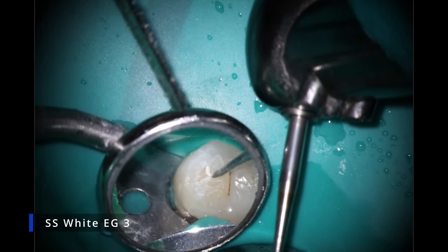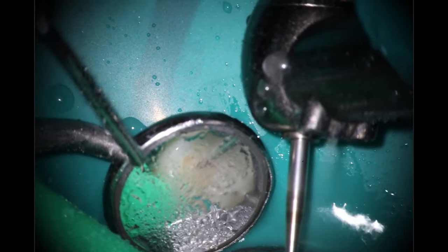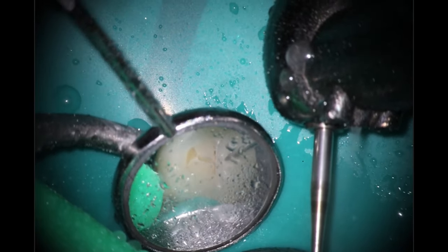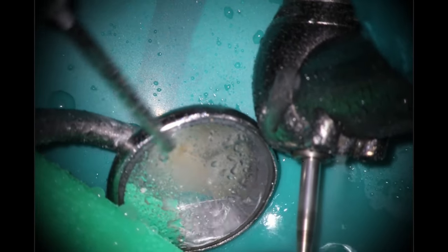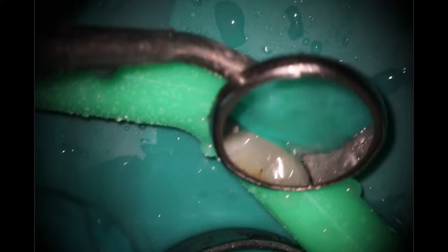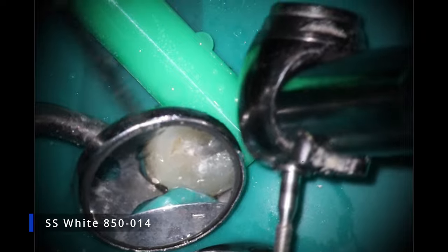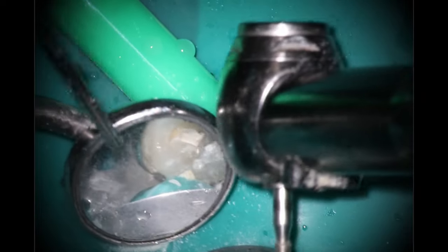As far as what we're going to start off with, I'm starting with the EG3 bur from SS White — it is an excellent bur. They are expensive, but they do work extremely well. The reason I'm using this is because I'm going to switch to a long tapered diamond, and recently the batches I've had just strip the diamonds off from the very tip, which is very annoying. So I like to get that initial purchase with the EG3, then I take this 850 bur — we call it the Workhorse from SS White — and that's what I do most of my access with.